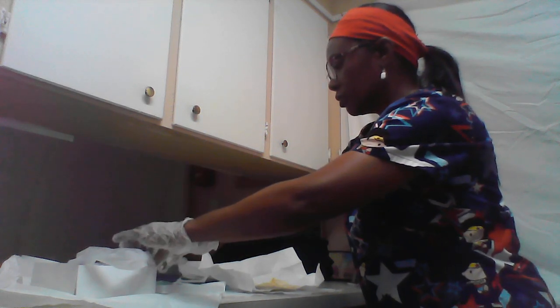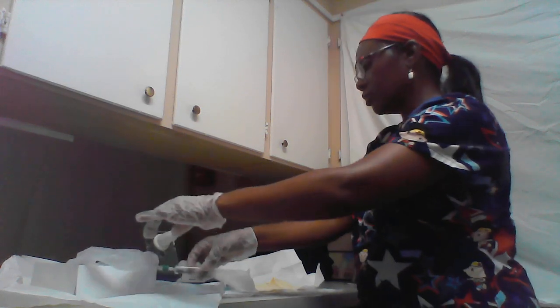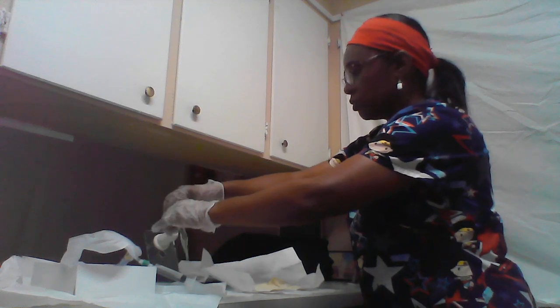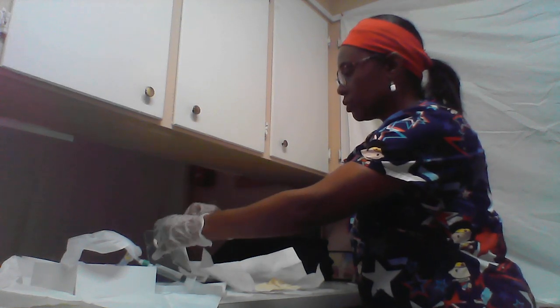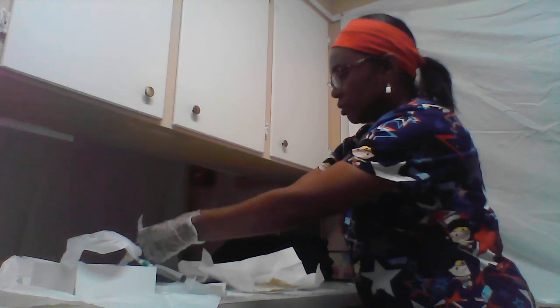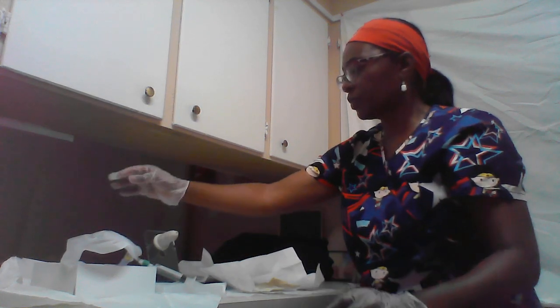During that time, I'm going to hook up the syringe to the catheter. And open up the alcohol swabs, and put it into the container.